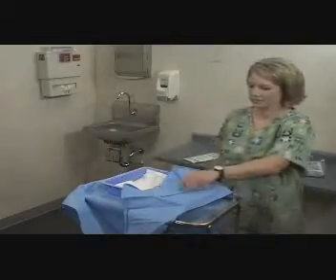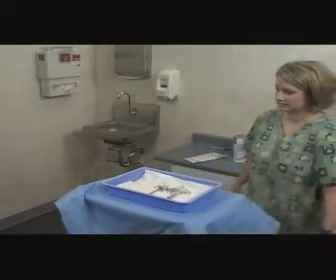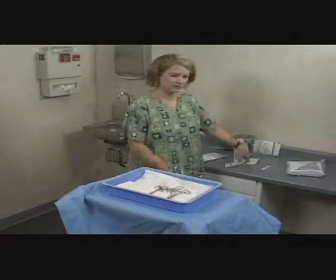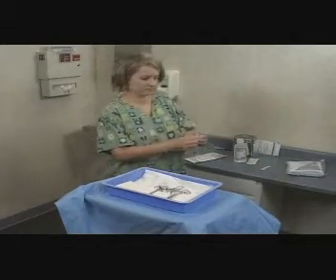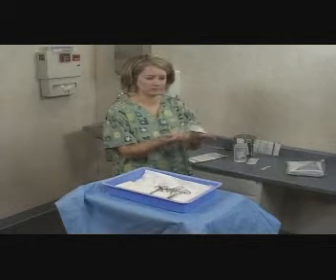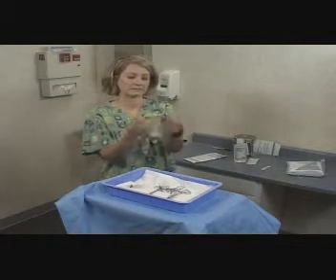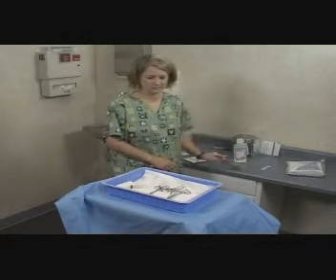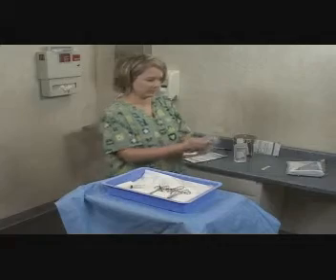She is careful to touch only the outside surface of the drape. If she adds additional items to the field, she must be careful not to reach across the field. She opens the additional items and carefully drops them onto the field. She must not allow the packaging to touch the sterile field. She opens packages away from the field to avoid contamination.